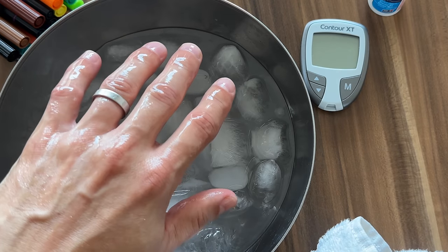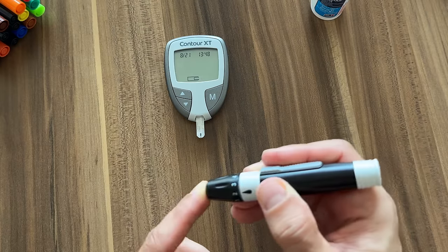I needed a guinea pig for this experiment but I didn't find anyone willing to let me prick their finger over and over again. So I was left with no choice — I'm the guinea pig, as always.